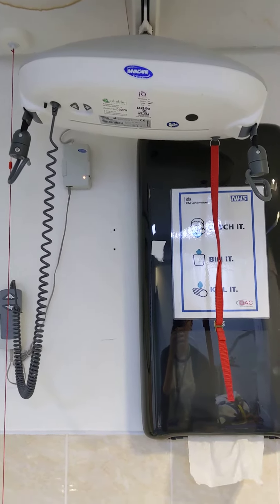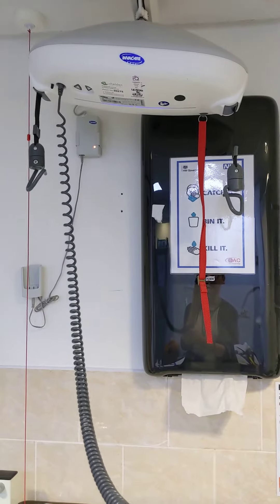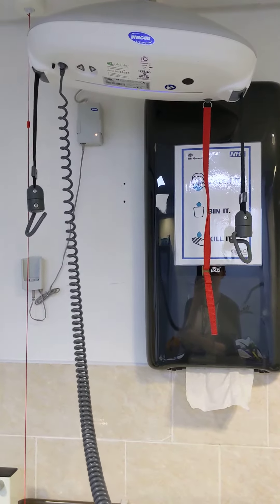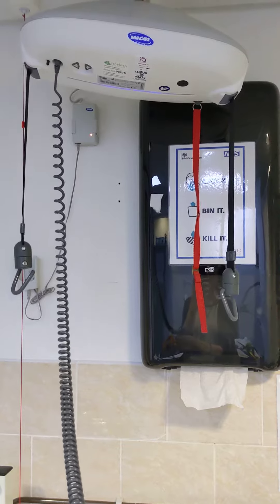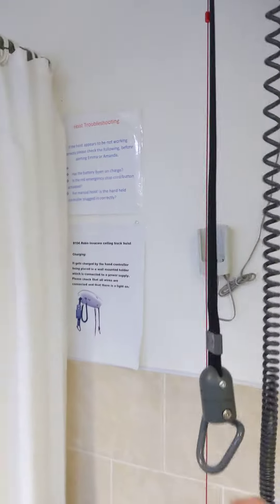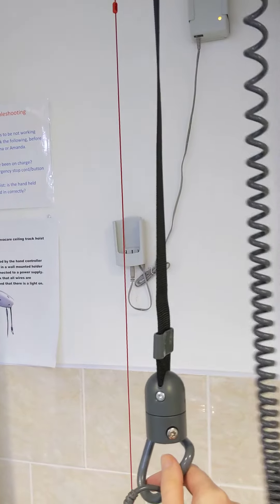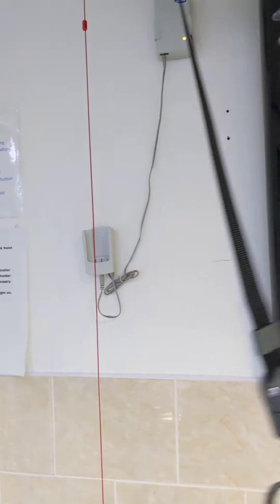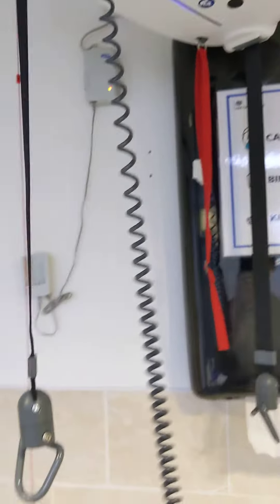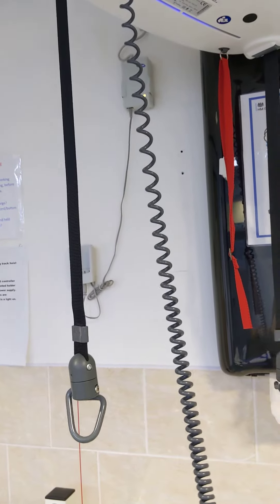With the Robin Invercare hoist, to make it go up and down you use the controller. You can see these are coming down. Now normally there'd be two of you, and one of the risks you need to be aware of is these metal things dangling down, which could potentially hit a student or staff. So you want to make sure that someone has always got a hold of them.